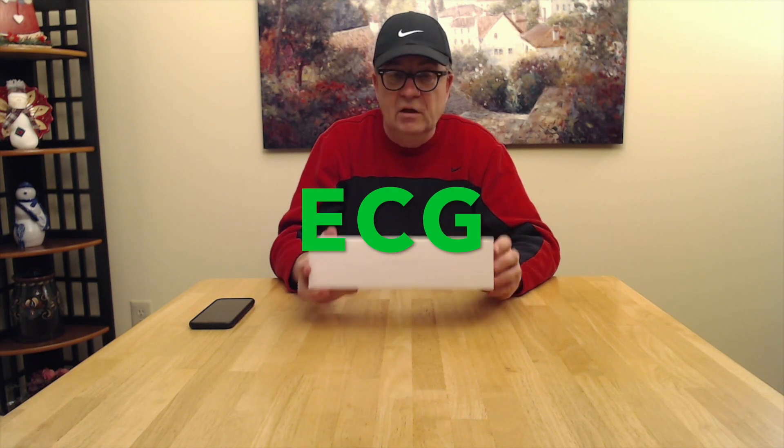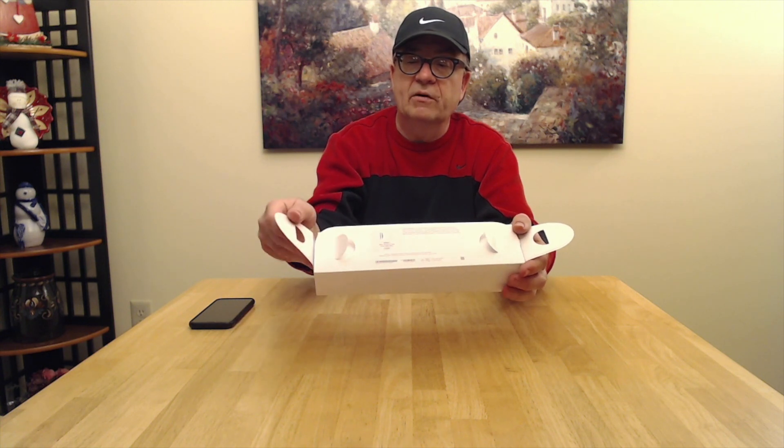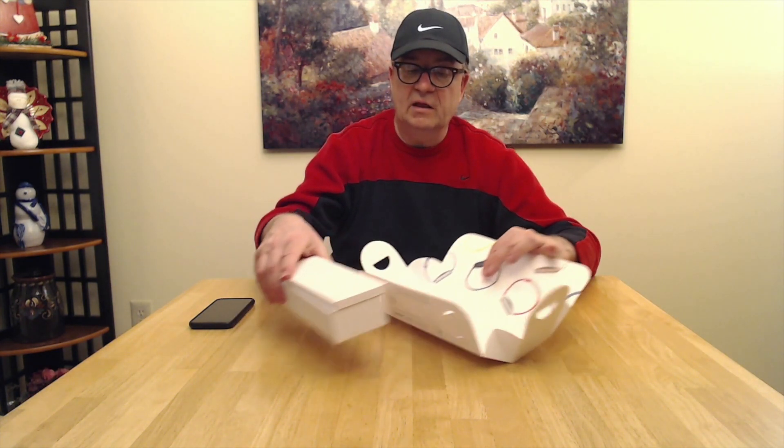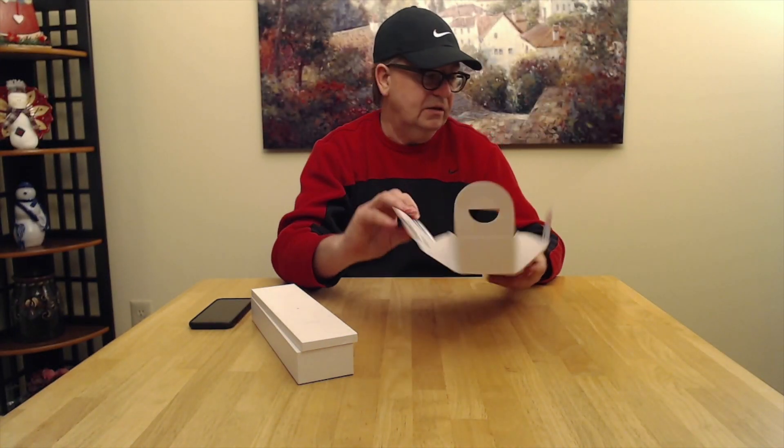So let's go for the quick unboxing. The watch box has a tab on the side here, so you pull this up then you pull that out — pull up, pull out. It's like fasteners but it's all paper. You get this really fancy inside of the box with the different color watches and bands, which is really nice.